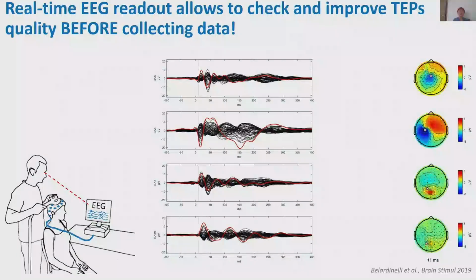The take-home message of this talk is that using a real-time EEG readout allows to check and improve TMS evoked potential's quality before collecting real data.